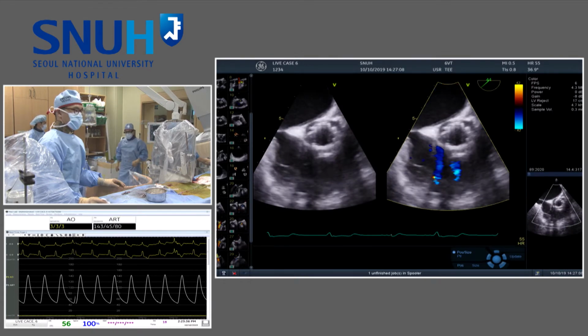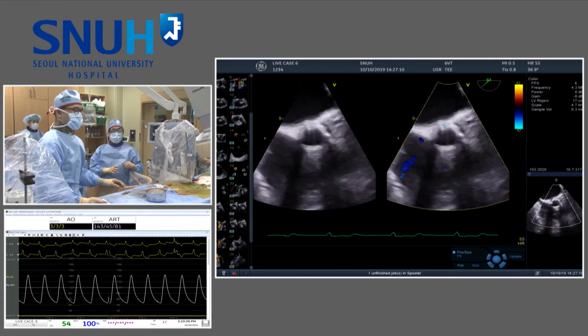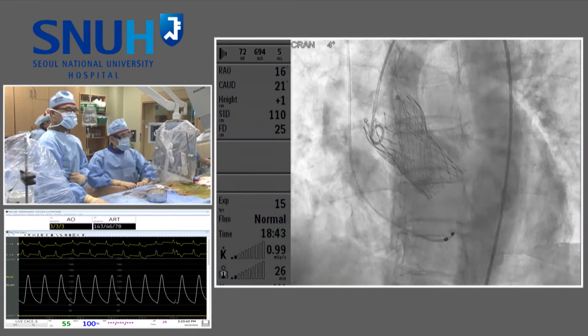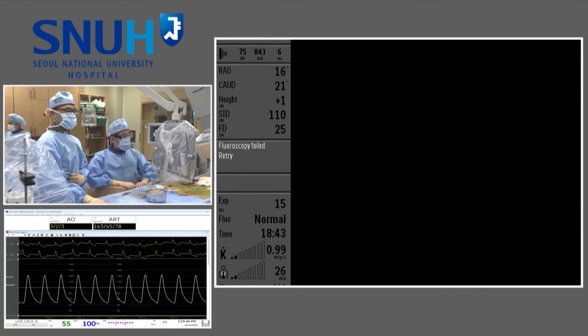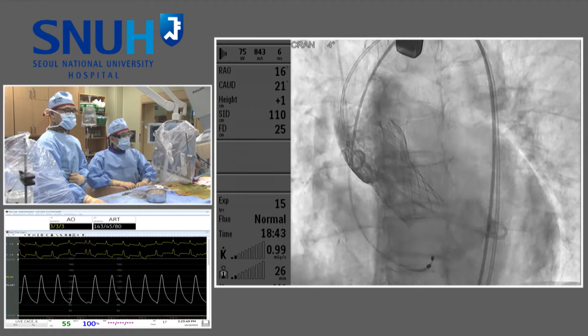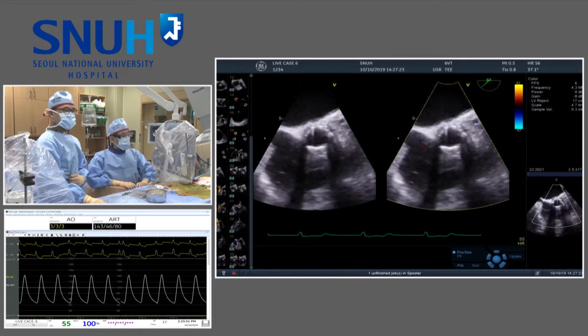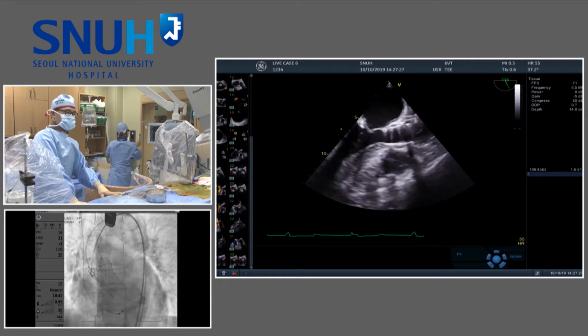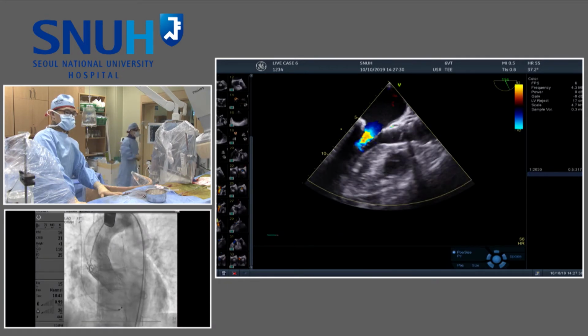I mean, I think if you did a survey of 100 people, you'd have a range of opinions. And it surprises me that even now, a decade into TAVR, we still don't understand the natural history of conduction disturbance, what it means to have transient disturbance during the TAVR, what it means to have transient or permanent left bundle. It surprises me that we don't yet understand that.